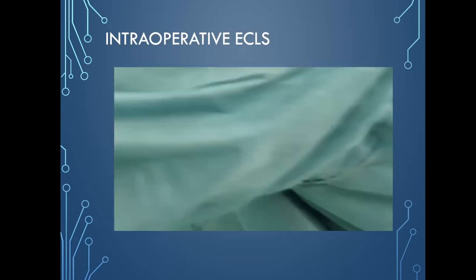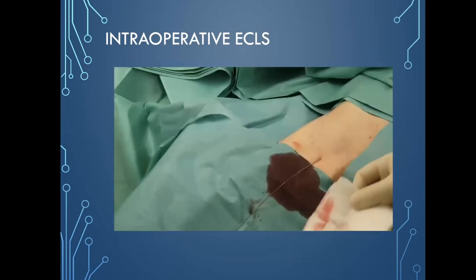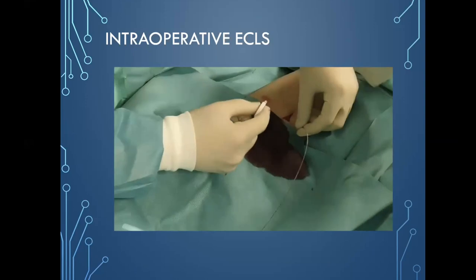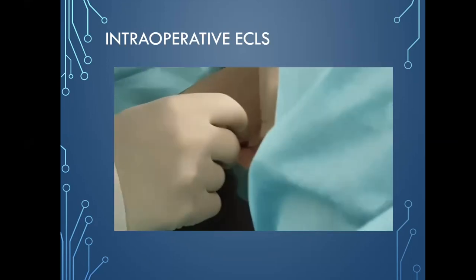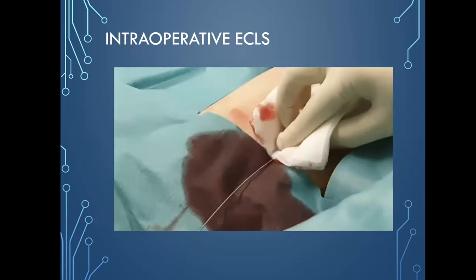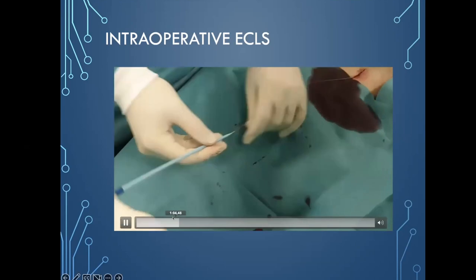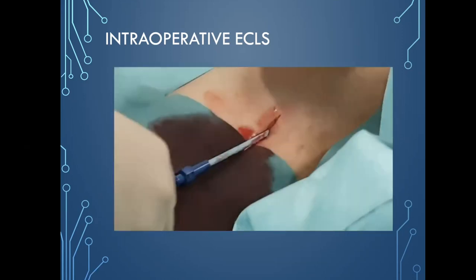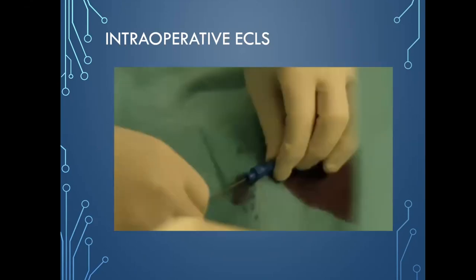And one very important aspect is to always think about removing the wire a few centimeters while entering your vessel dilator, because if you enter the vessel dilator and do not retrieve your wire for a few centimeters, you're going to get a small kink in the wire, and this is the source of a lot of problems. So avoid that by just pulling your wire back 1 or 2 centimeters at the moment you insert your dilator. There are usually 4 dilators up to 18 French, and here you see the assistant exactly pulling the wire a little bit away while inserting, and then you make sure that your wire is going smoothly. So then you know everything is going well. You're not going to have complications.